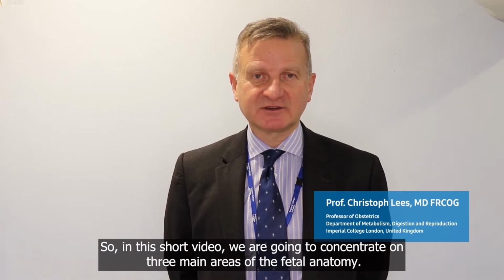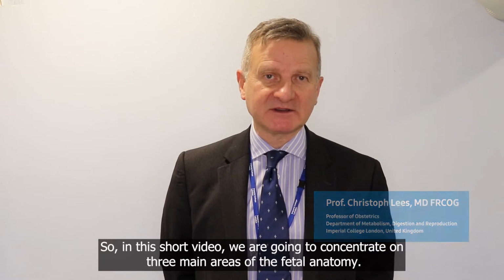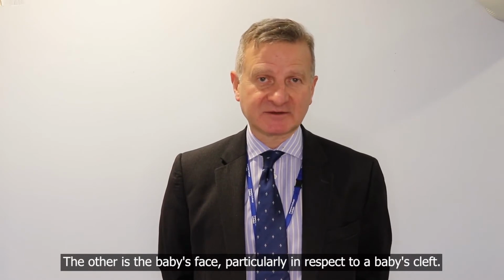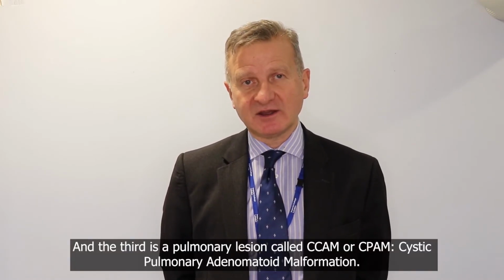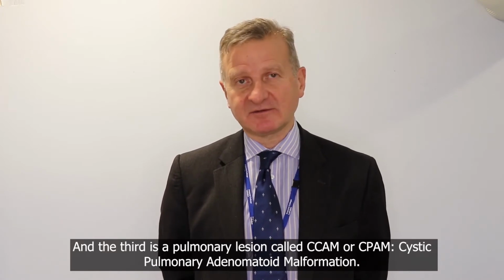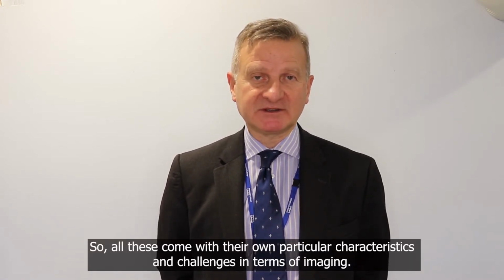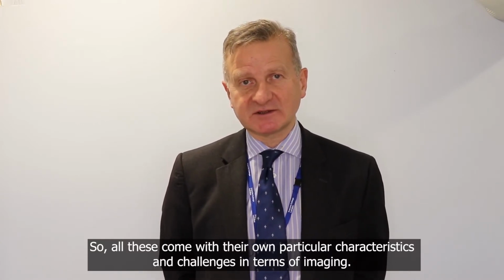So in this short video we are going to concentrate on three main areas of the fetal anatomy. One is baby's spine, the other is looking at baby's face, particularly in respect to a baby's cleft, and the third is a pulmonary lesion called CPAM, cystic pulmonary adenomatoid malformation. So all these come with their own particular characteristics and challenges in terms of imaging.